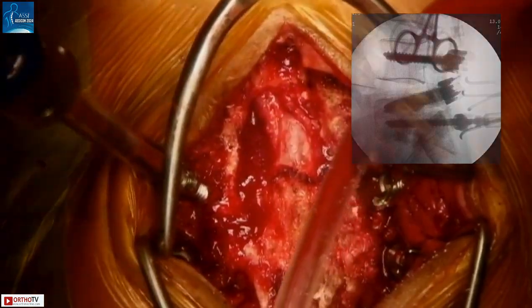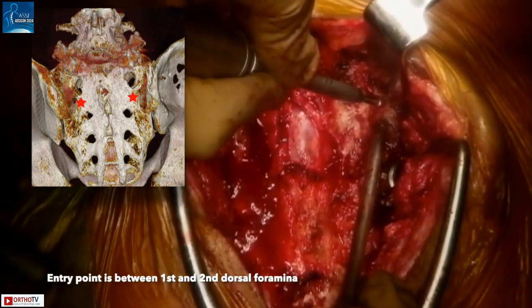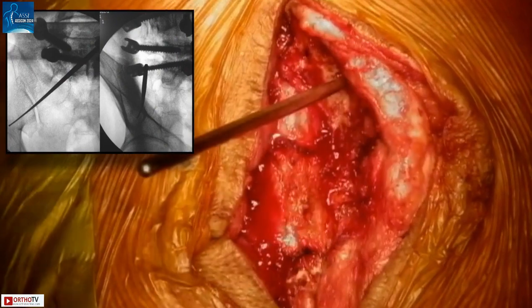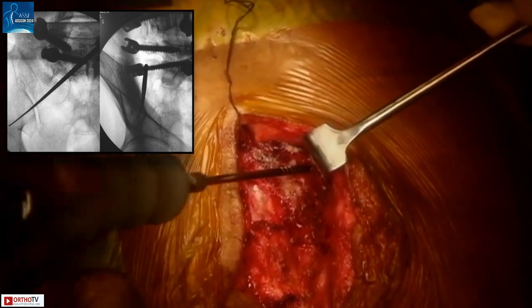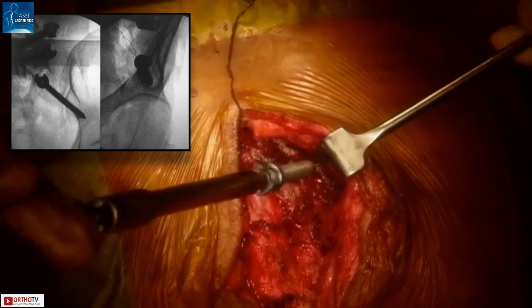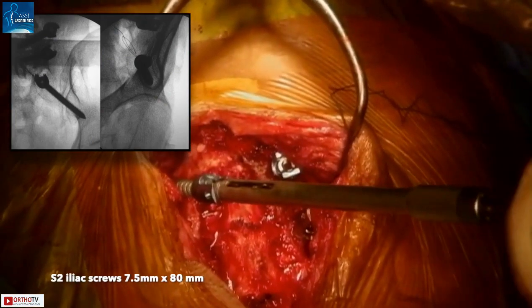Using a Penfield, the first dorsal sacral foramen is identified. The entry point for the iliac screw is between the first and second dorsal foramina. The trajectory is directed approximately towards the greater trochanter and around 30 degrees anterior from the floor. AP and teardrop fluoroscopic views confirm accurate trajectory. The 7.5 mm × 80 mm iliac screws are placed on both sides, and fluoroscopic imaging is used to confirm accurate placement.